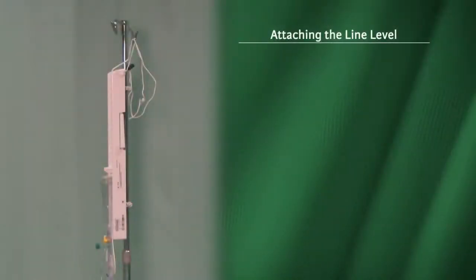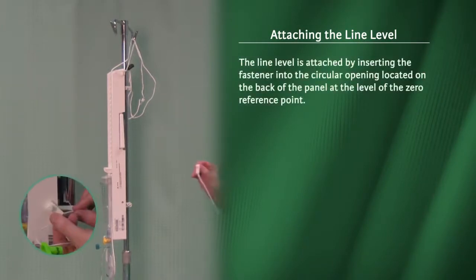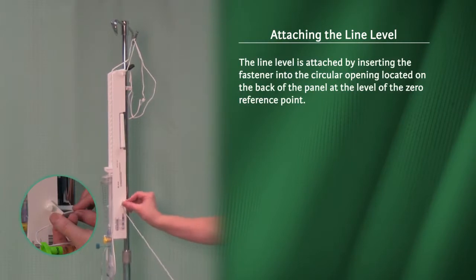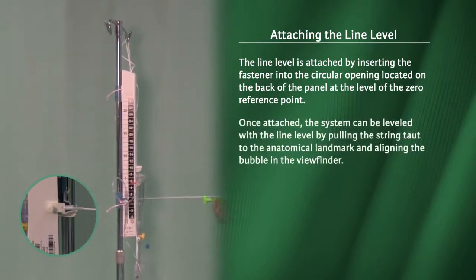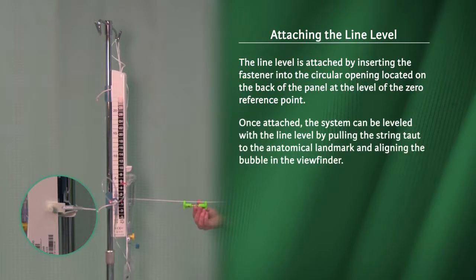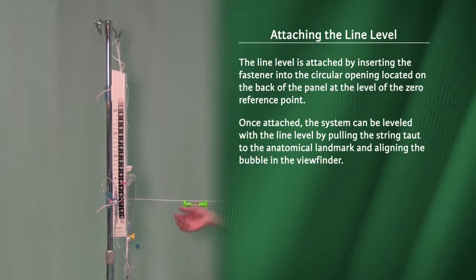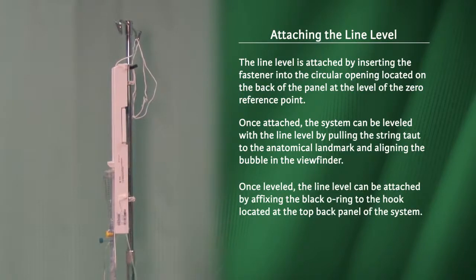Attaching the line level. The line level is attached by inserting the fastener into the circular opening located on the back of the panel at the level of the zero reference point. Once attached, the system can be leveled with the line level by pulling the string taut to the anatomical landmark and aligning the bubble in the viewfinder. Once leveled, the line level can be attached by affixing the black o-ring to the hook located at the top back panel of the system.